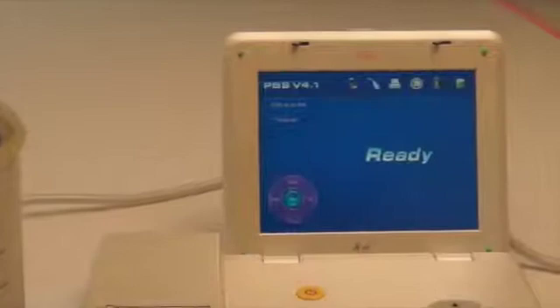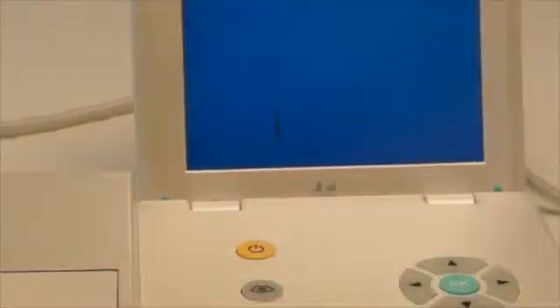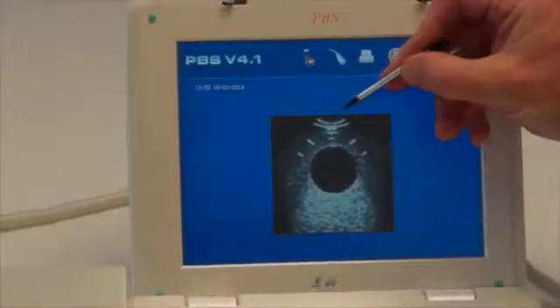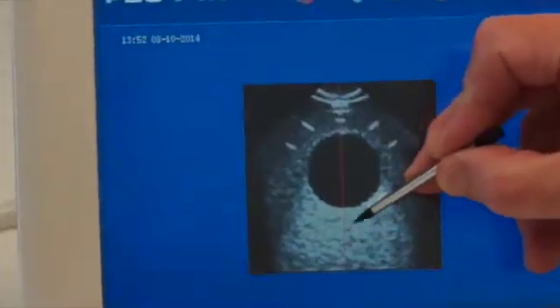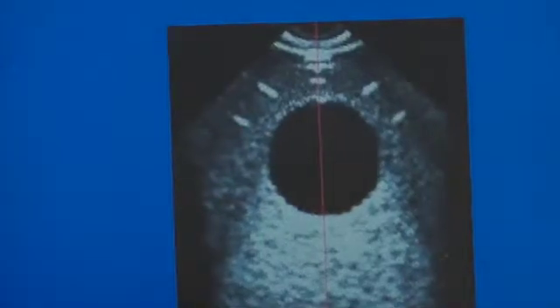When you press the Scan button, you will see on the screen a display which shows the image of the Phantom Bladder. You'll notice that there's a red line which runs down through the center of where the sphere is, which is the Phantom Bladder inside.